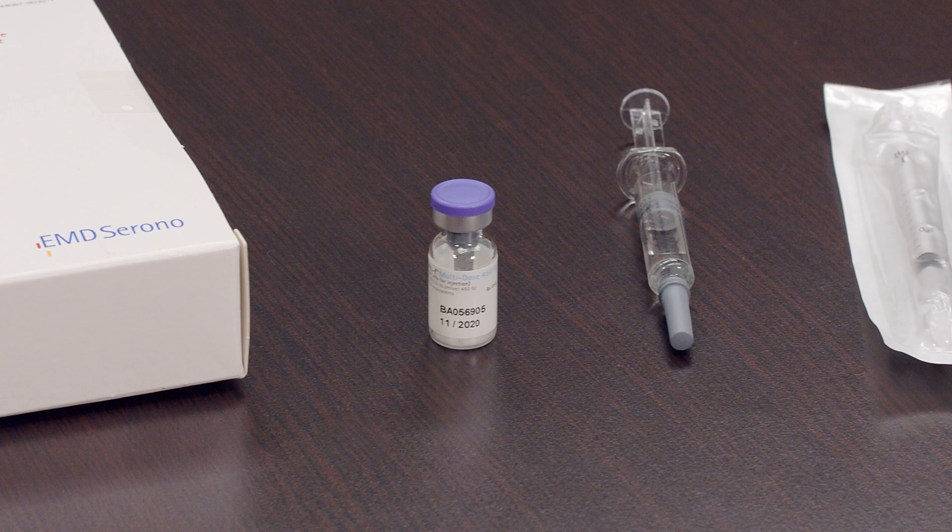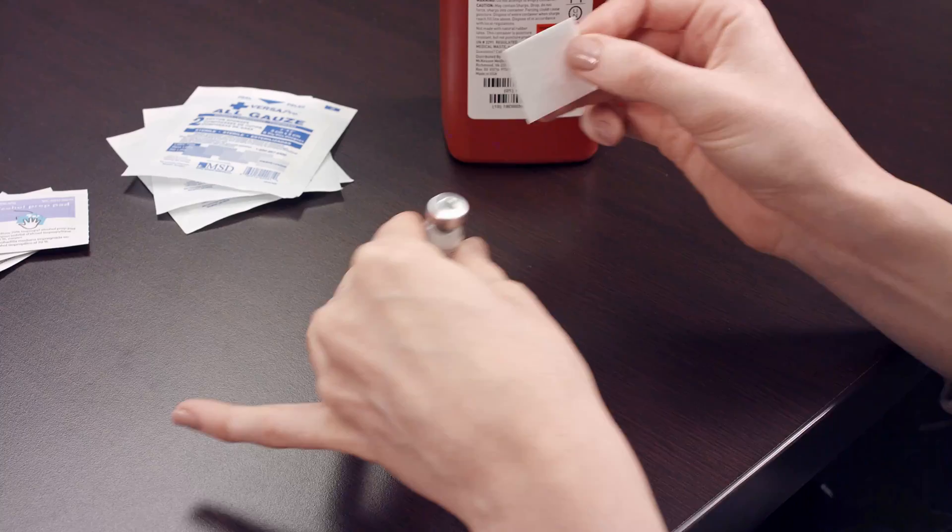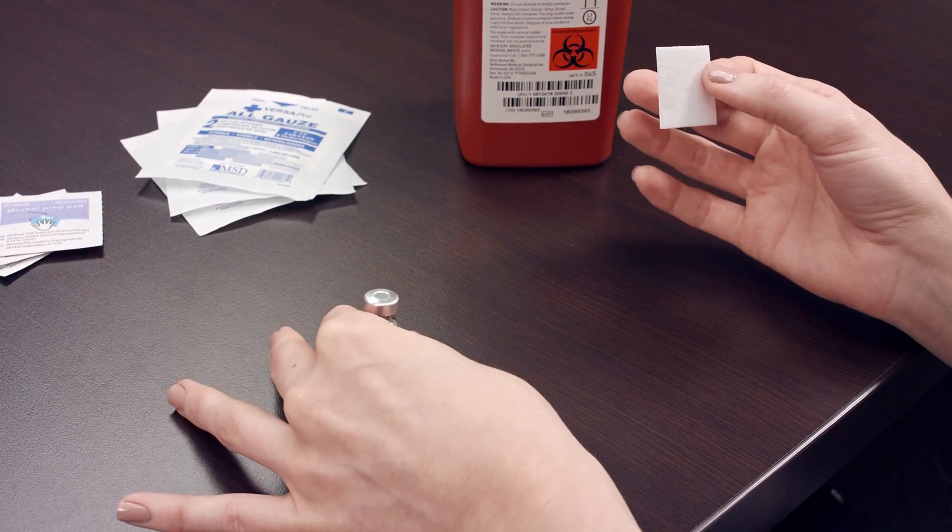The Gonal-F multi-dose vial can be stored at room temperature or refrigerated for up to 28 days. Remove the cap from the Gonal-F multi-dose vial and disinfect by wiping the top with an alcohol prep wipe.